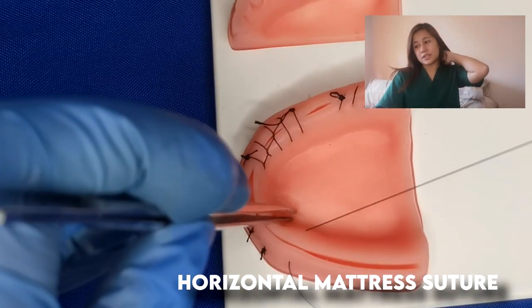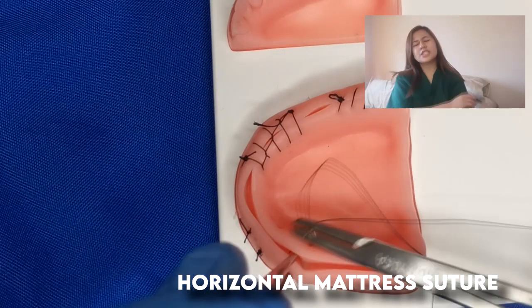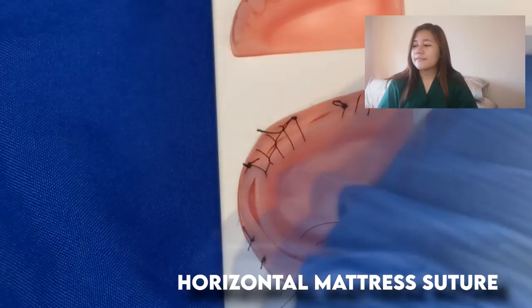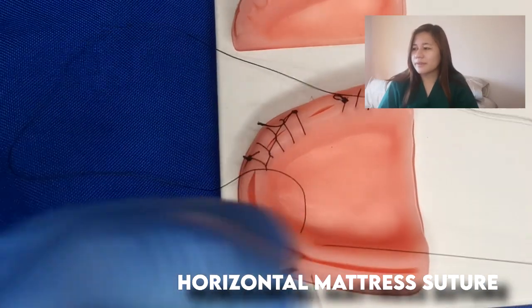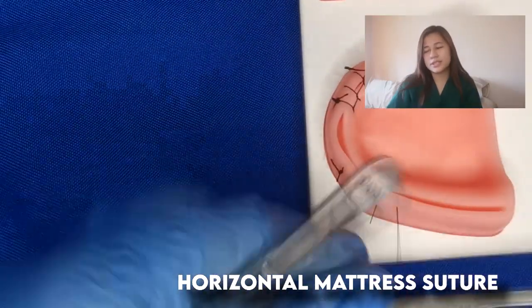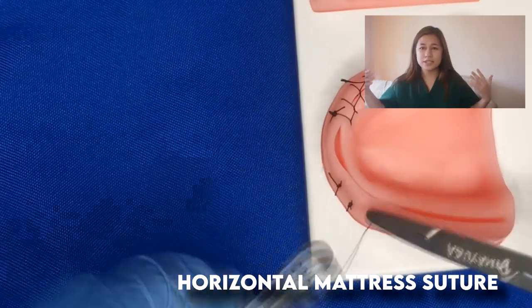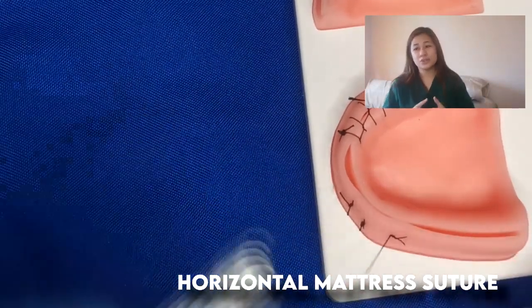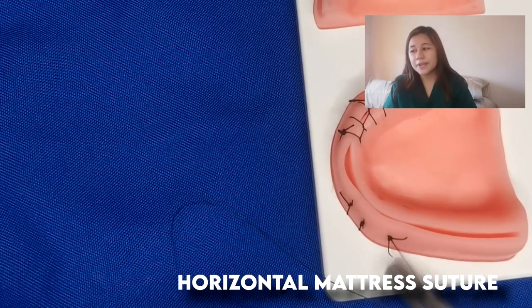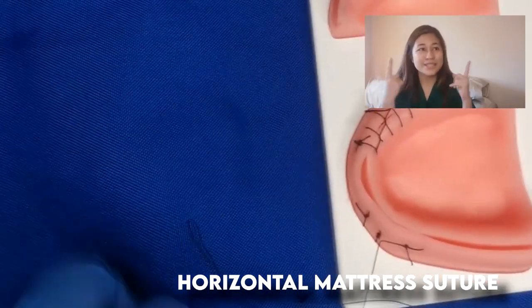Next one is the horizontal mattress suture. The horizontal mattress suture is the strongest type of suture. It's very far away, like 8 millimeters from the edge. Why do I say it's far away? It's indicated for large distances between tissues. Also, it's good for bone grafts, implants, and closure of extraction socket. So it's really nice, as you can see.